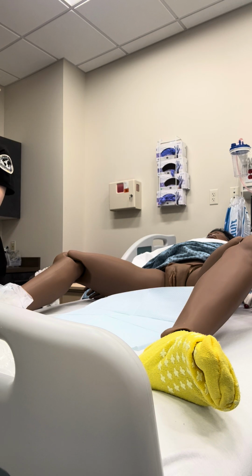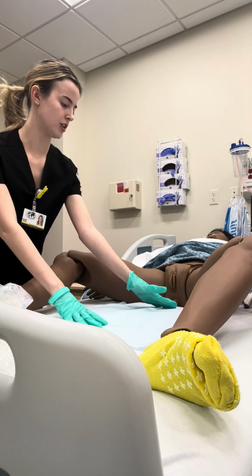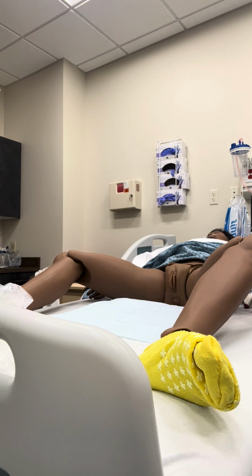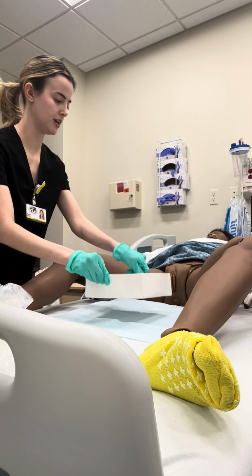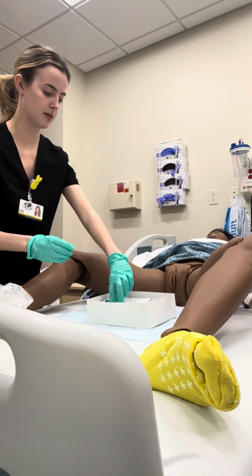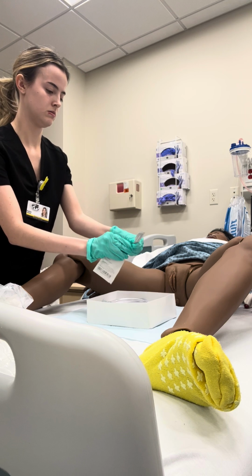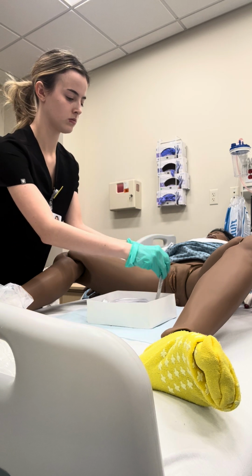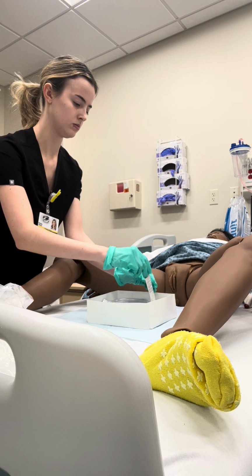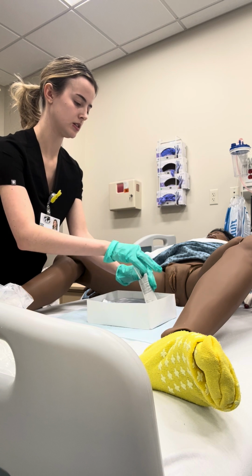And now I am going to move my sterile field, fix the drape, and I'm going to move my supplies over here. And then I'm going to get everything set up. Get these loose, make sure they're easy to get out.